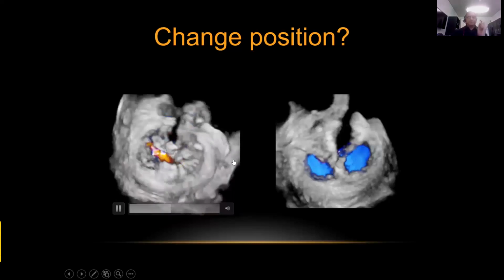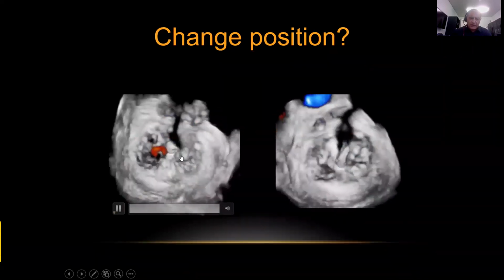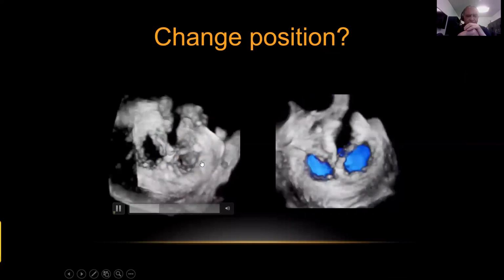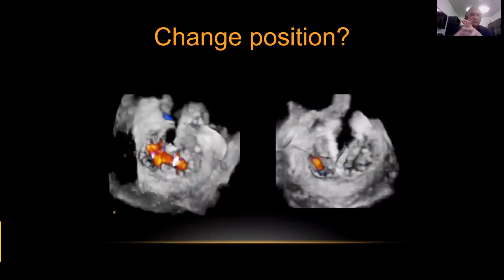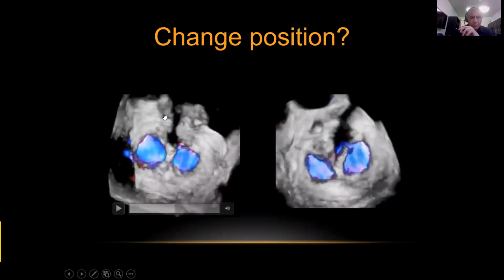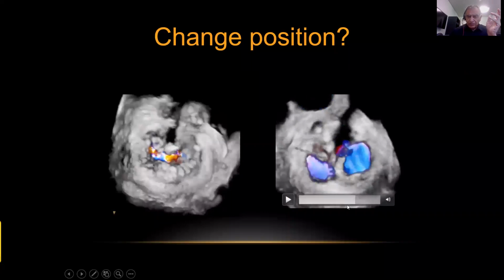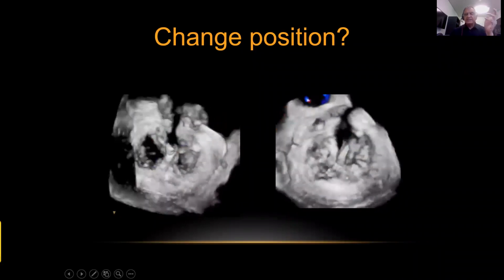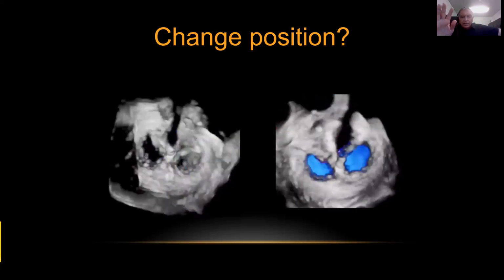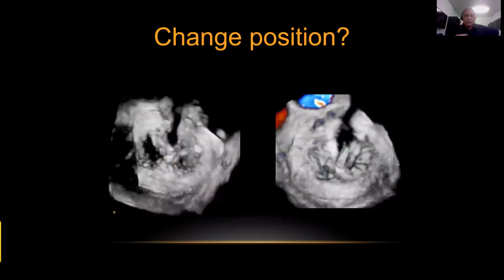And what about this? This was a little more difficult, because you don't know if the residual leak was from here or from here, because the clip was central. So the first attempt was just to change the position. If you look at these images, you can see that the clip is not completely in this way, but a little bit oblique. So we decided to change the position, and when the clip is now here, this mild to moderate mitral regurgitation disappears altogether. So sometimes it can be useful to just change the position without putting another clip, and then you can have good results.